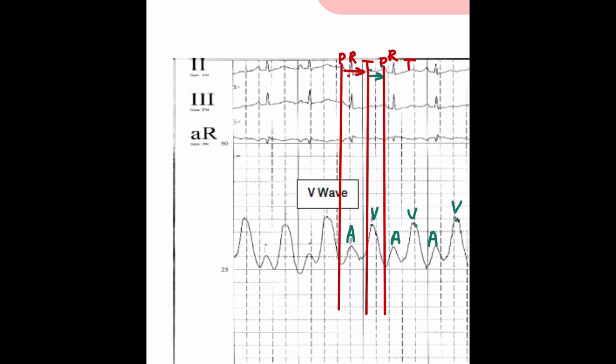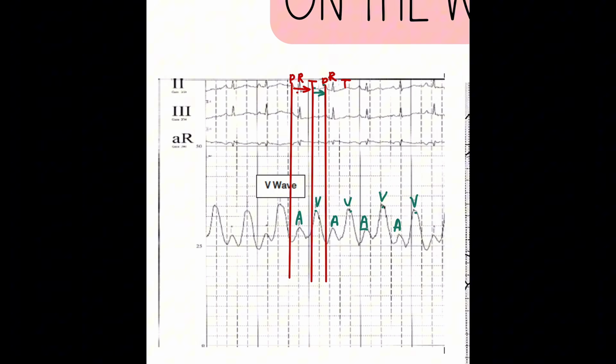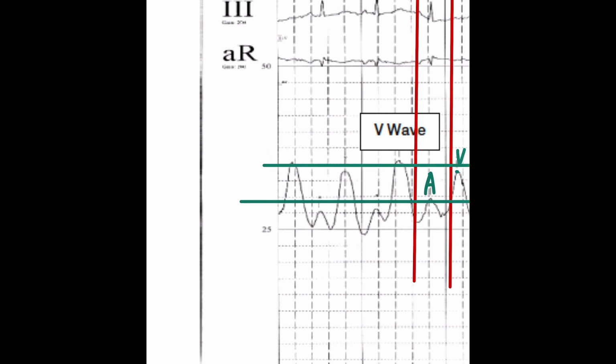This is probably in 5s, right? 25, 30, 35, 40. Oh, no, it's not. What the heck? So if you marched out this scale, let's just use this to estimate the A and the V. This scale is in increments of 2.5, which is not super nice. So this is about 25, 27.5, I don't know, maybe 28.